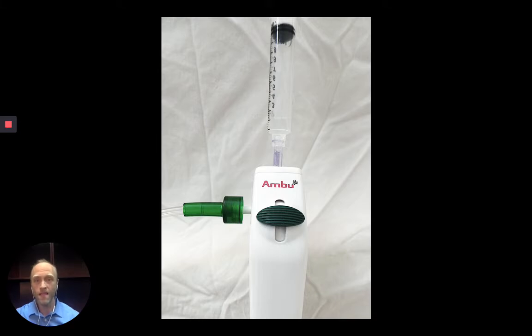In my experience, when delivering lidocaine through the scope, people tend to give more volume than is necessary. Patients generally need only additional 1 to 2 mL of lidocaine. So in order to deliver that, fill the syringe with lidocaine along with 8 mL of air in order to push the liquid through the working channel of the scope and drip it onto the epiglottis and larynx. Now that the patient is adequately topicalized, it is time to insert the device and deliver the tube.